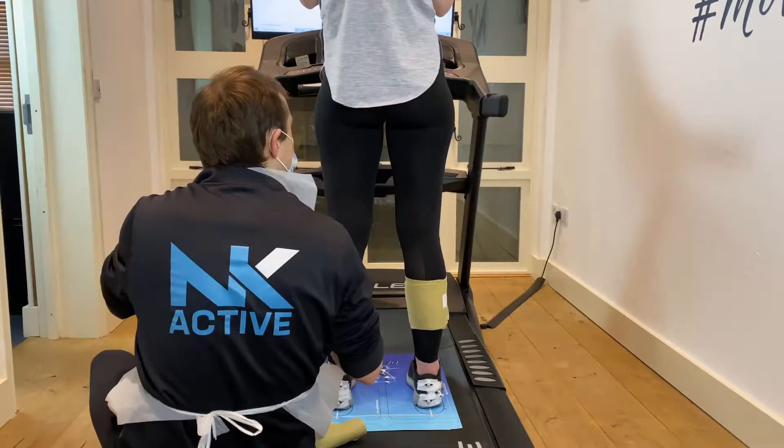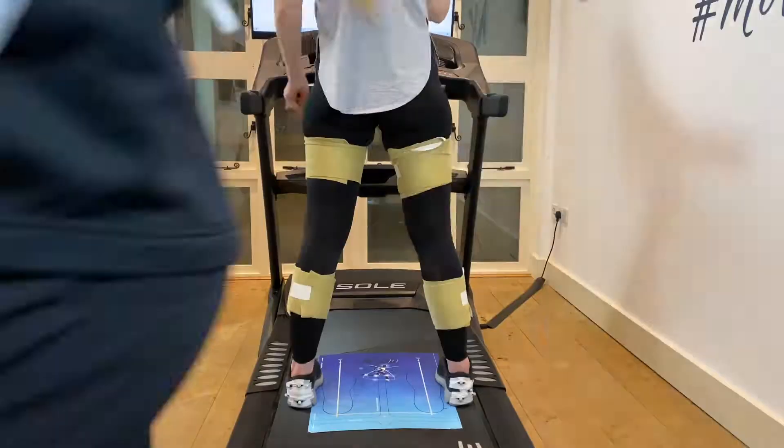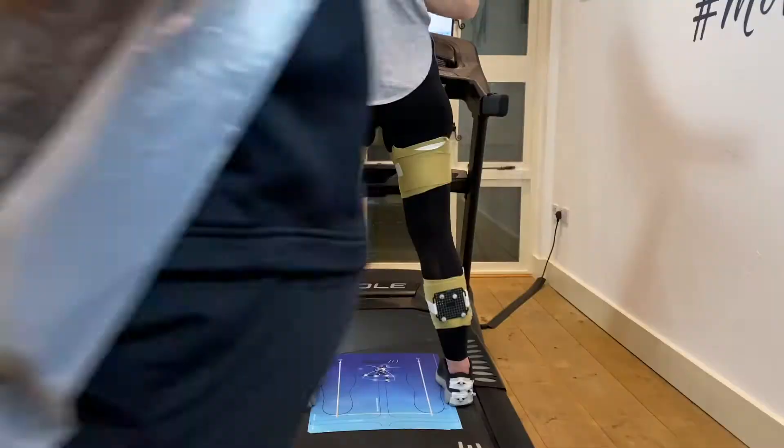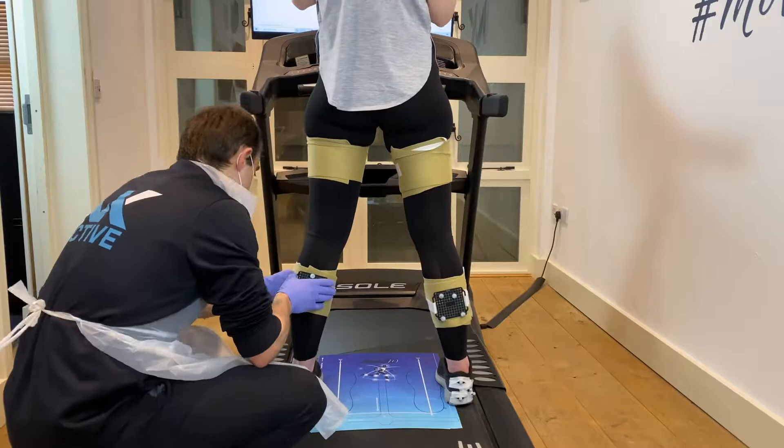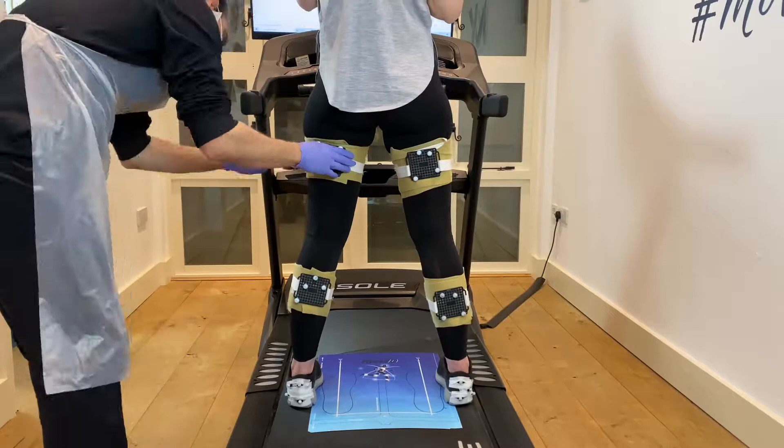This is then followed by sticking all these reflective markers to the lower limb, and this is extremely important because this is what the cameras are looking for. They're going to be looking for these little clusters and dots that have been applied, and from this they're going to build a 3D skeleton of the lower limb.